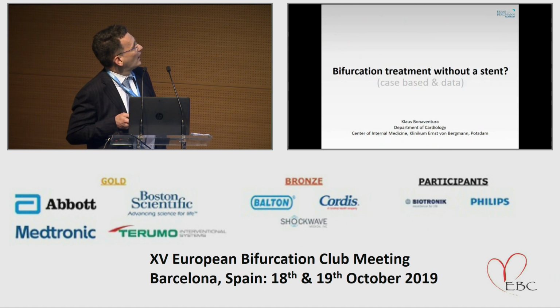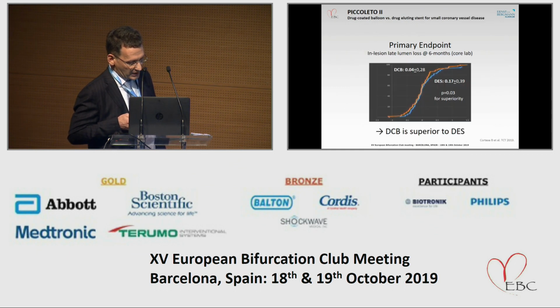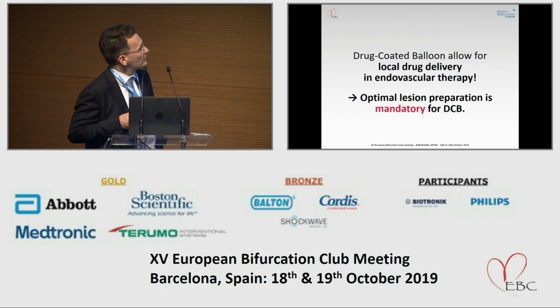ISR. The 4th speaker, Klaus Bonaventura, detailed results according to the vessel diameter where they are used. He presented step by step the German consensus algorithm regarding the use of DEB and showed us some beautiful cases. Actually, from studies such as Basket Small or Bello or Piccoletto, DEB were proven to be not only non-inferior but actually superior when it comes to the late lumen loss regarding the treatment of small vessels smaller than 2.8 millimeters.